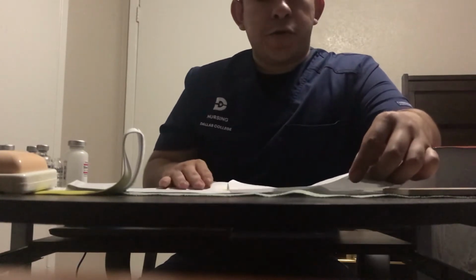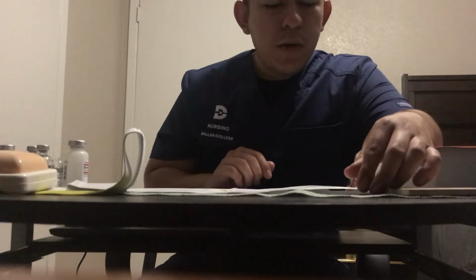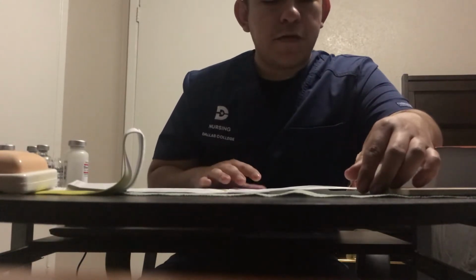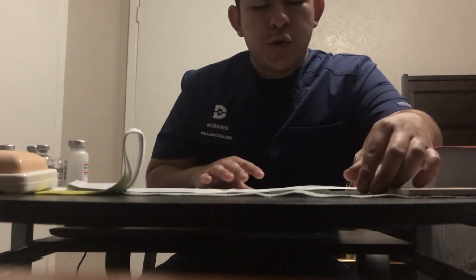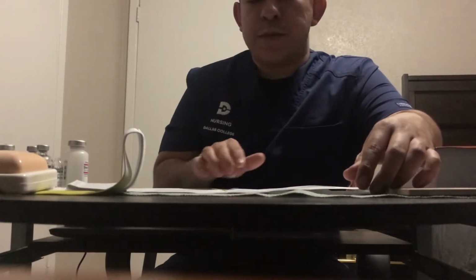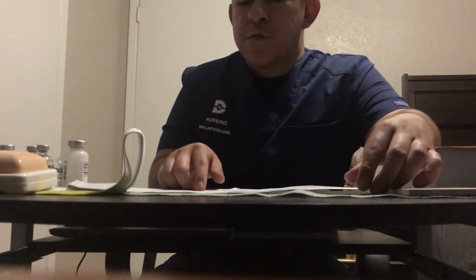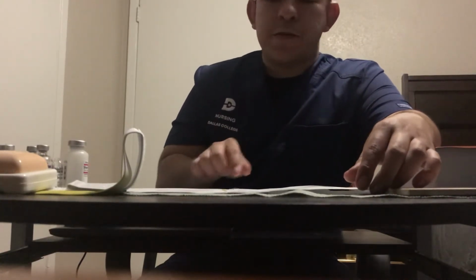So now the doctor ordered 1 gram of ceftriaxone IM Q 12 hours for infection. Reconstitute in 2.5 mLs of sterile water, and that matches with what is in the medication record.